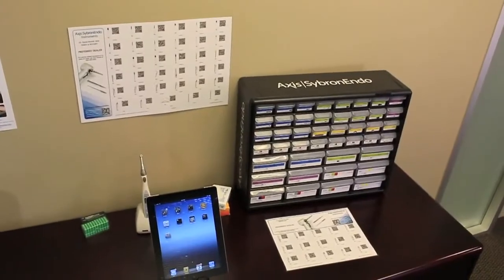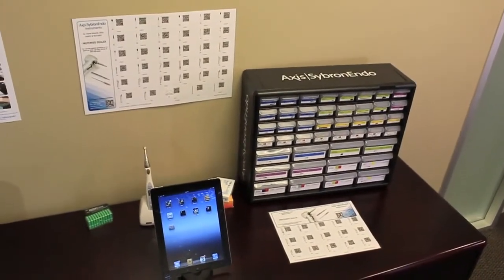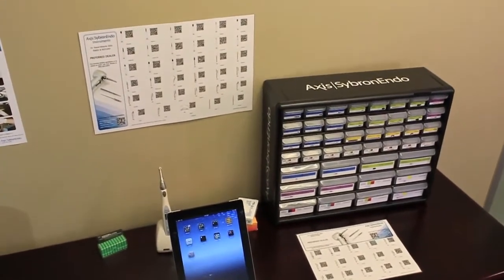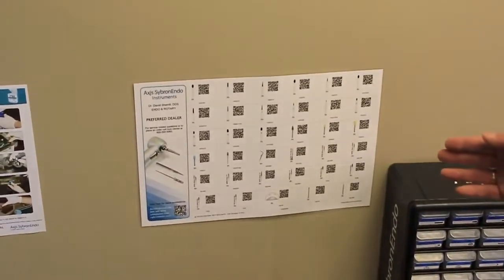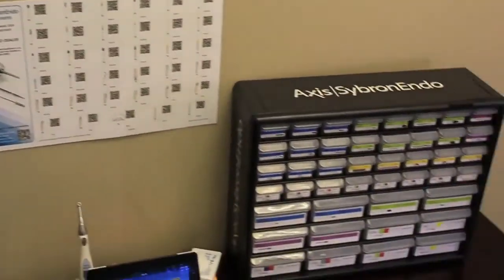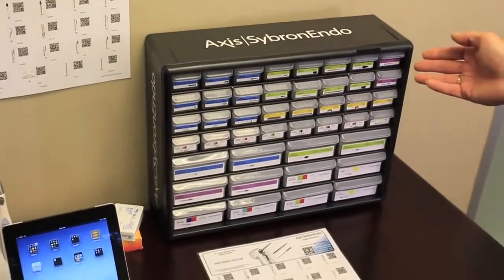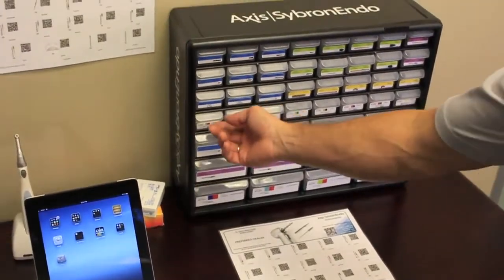This is a brief demonstration of the newest version of our QR Code Logic OS system. The Logic OS system consists of custom wall charts, custom organizer cabinets for your instruments, and custom drawer inserts for those organizers.